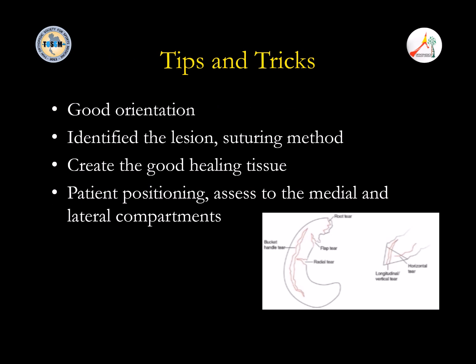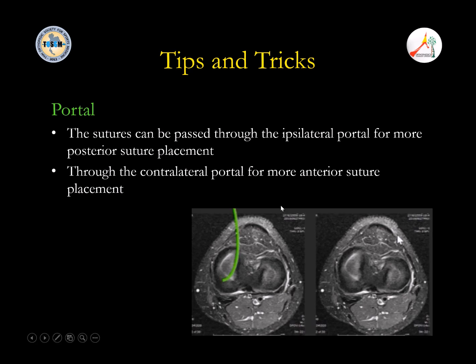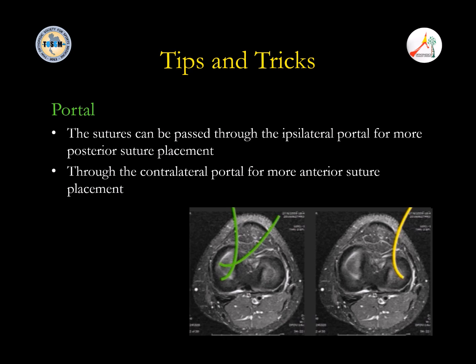I will tell you the tips and tricks for meniscus repair. First, your portal must be at the joint line level. Otherwise, you cannot put the instrument in. The trick is you bend the knee to 90 degrees and palpate the lower patella. That's the area of the joint line. If you go a little too high or too low, you cannot work, because with the meniscus you have only a very narrow area to repair. So keep your portal at the joint line level.